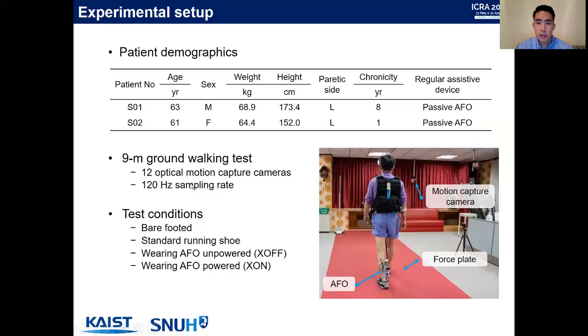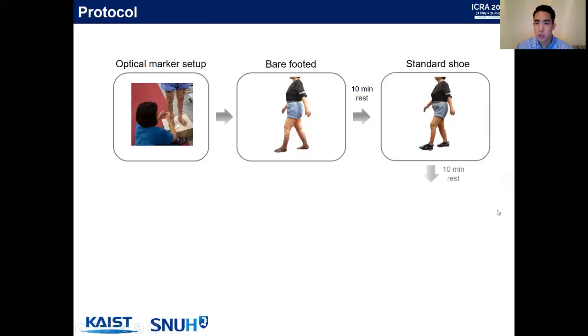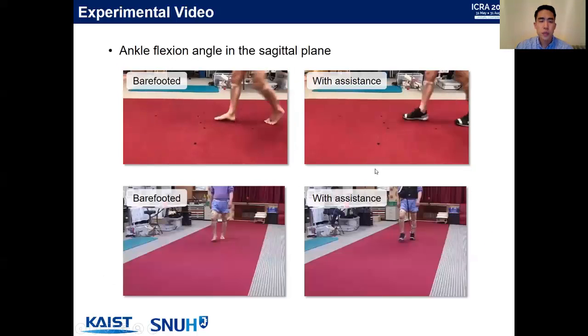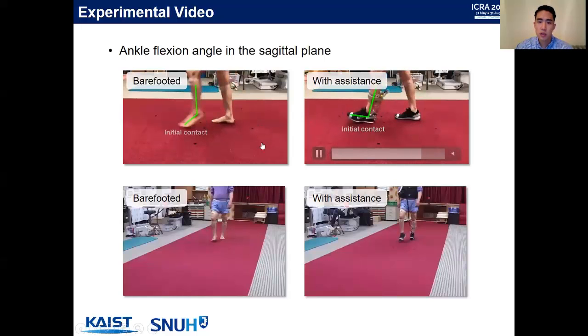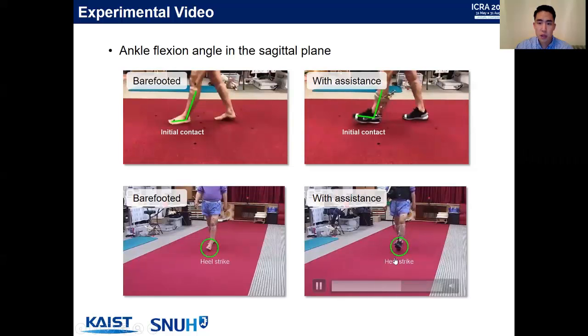We validated our system on two drop foot patients. We performed a nine-meter ground walking test equipped with 12 optical motion capture cameras, comparing four conditions: barefooted, standard running shoe, AFO unpowered, and AFO powered. Optical markers were set, followed by each condition with 10-minute rest periods between them. In the experimental video, you can see that swing phase kinematics improved, as did initial contact. In the frontal view, the toe is visibly lifted during the swing phase and during heel strike.